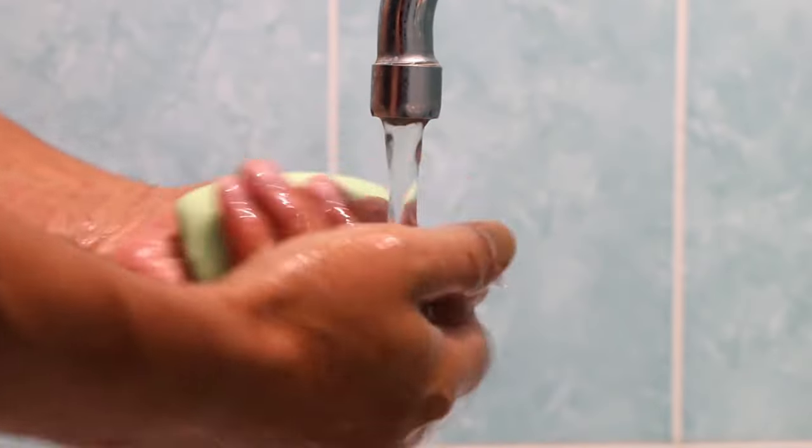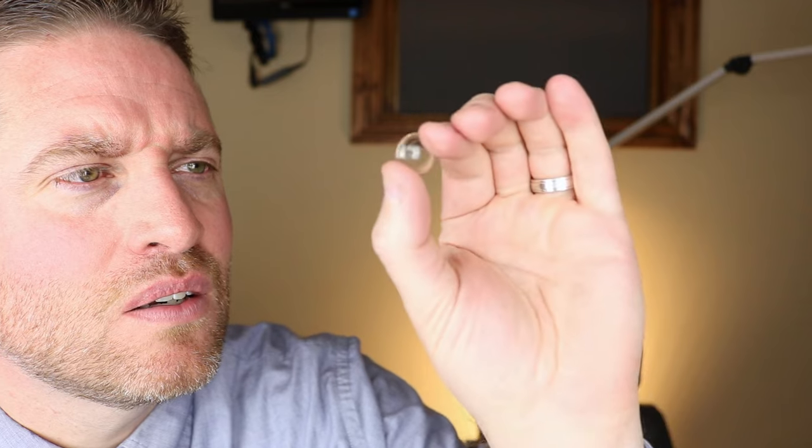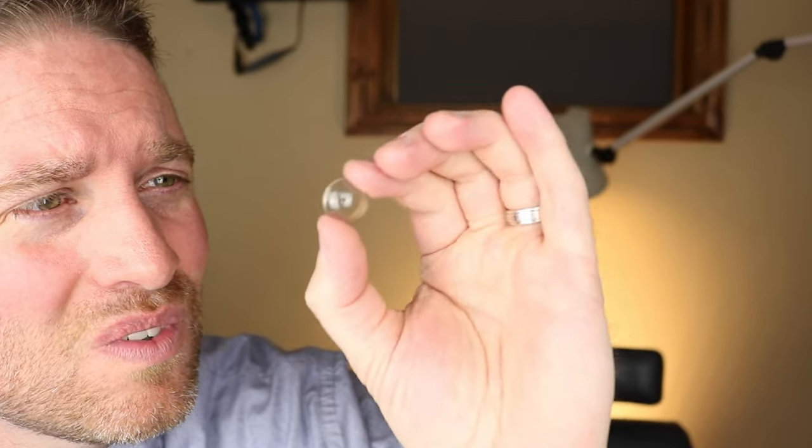Let's first get prepared to put the scleral contact lens in. Start off by washing your hands. Now identify the right and the left contact lens. Inspect the contact lenses — make sure they're clean, free of any lint or dust, and make sure there aren't any chips or cracks in the lenses because you don't want to be putting that in your eye. Before you get the contact lens ready, get a mirror ready and lay it flat just like this.